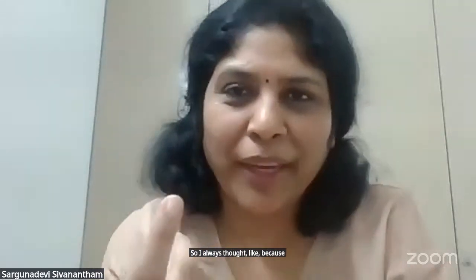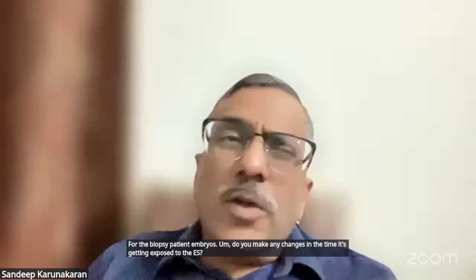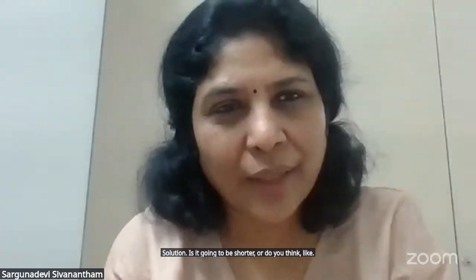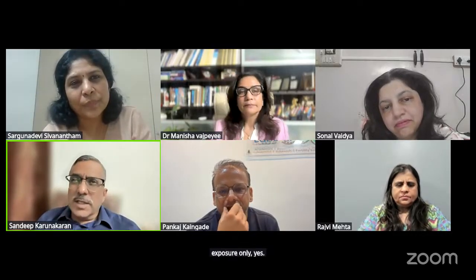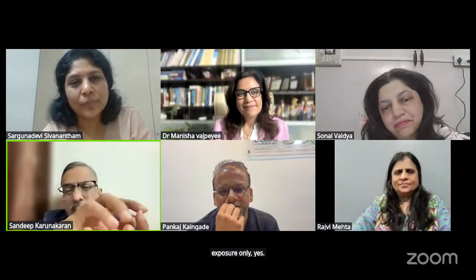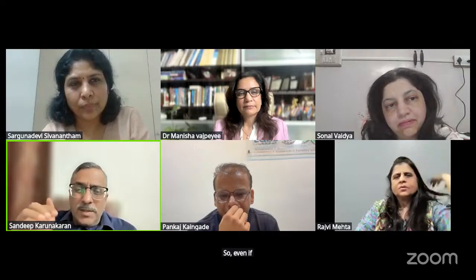I have a question for Dr. Sandeep and any of the embryologists here. Because of the hole we are making with the laser shots for the biopsy, do you make any changes in the time the embryo is exposed to the ES solution? Not really, there's no difference. Is it going to be shorter, or is the change quicker because you have a hole? It is not a hole; it's an entire slit. It's like a ball. When you slit it open, the laser opens it like this, and then it closes back. It is not a single punctate hole. Once the laser goes through, you have to pull the tissue out, and once the biopsy is done and the entire tissue has gone back into the zona, generally the slit collapses.